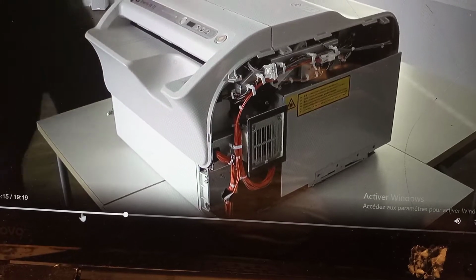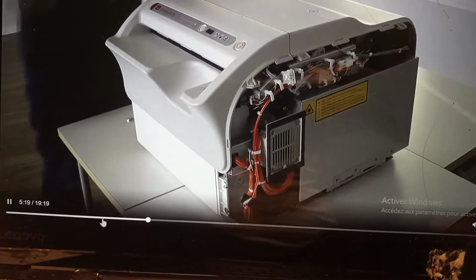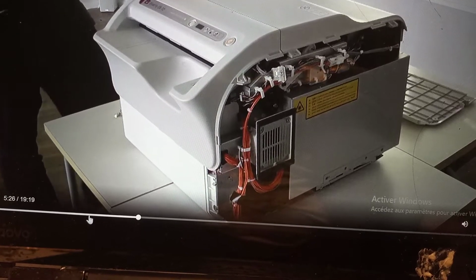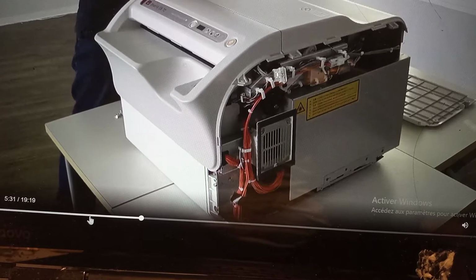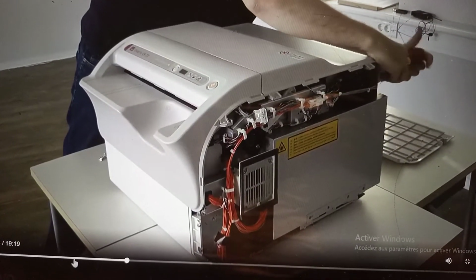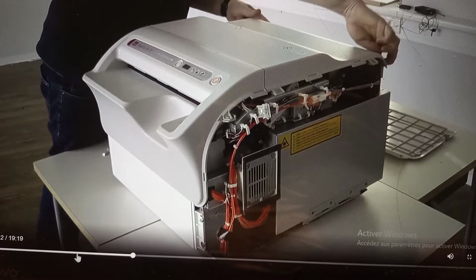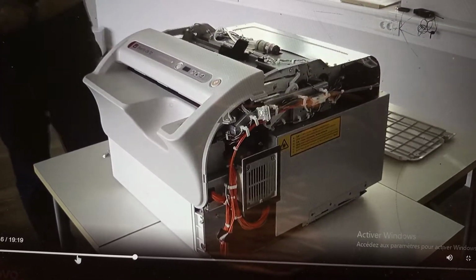For this, first we need to remove 6 screws on the backside, so we can remove the backside like this. And after that, we need to remove 6 screws from the top cover to remove it. Two screws here, 2 screws here, and 2 screws on the backside. And after that, it's possible to remove the top cover.